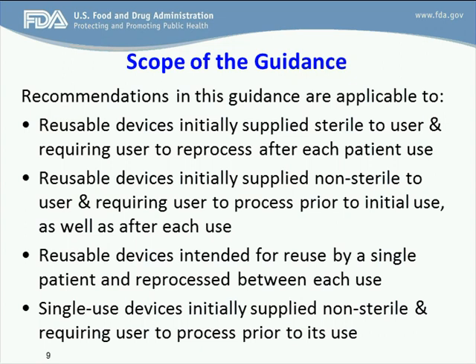Third, reusable devices that are intended for use by a single patient and are to be reprocessed between each use. And fourth, single-use devices that are supplied as non-sterile to the user and requires the user to process prior to its use.